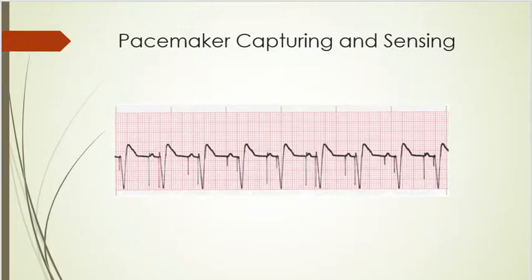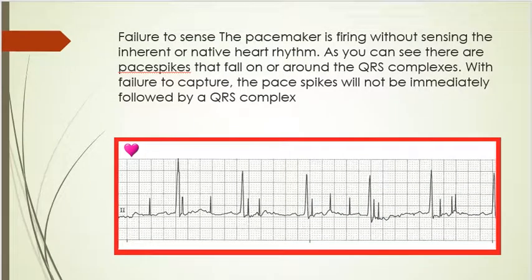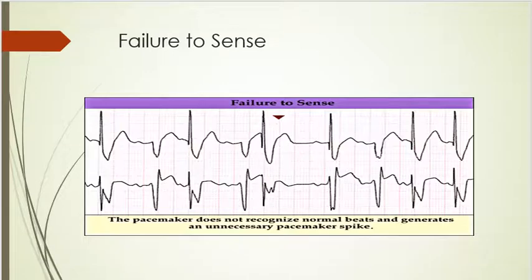Okay. Now, just for your knowledge, because you'll take care of patients with permanent pacemakers: if you see a patient with a pacemaker who gets admitted because they're having syncopal episodes, it's probably going to be one of these reasons. It's going to be either failure to sense or failure to capture, and so they have to come in with a computer and do what is called an interrogation of that pacemaker.